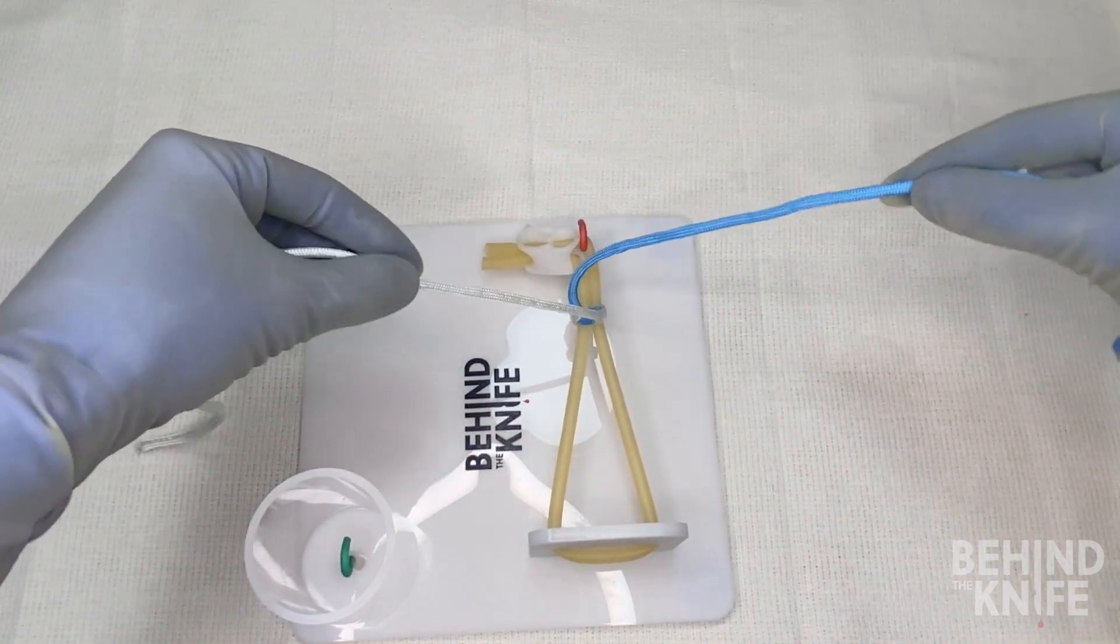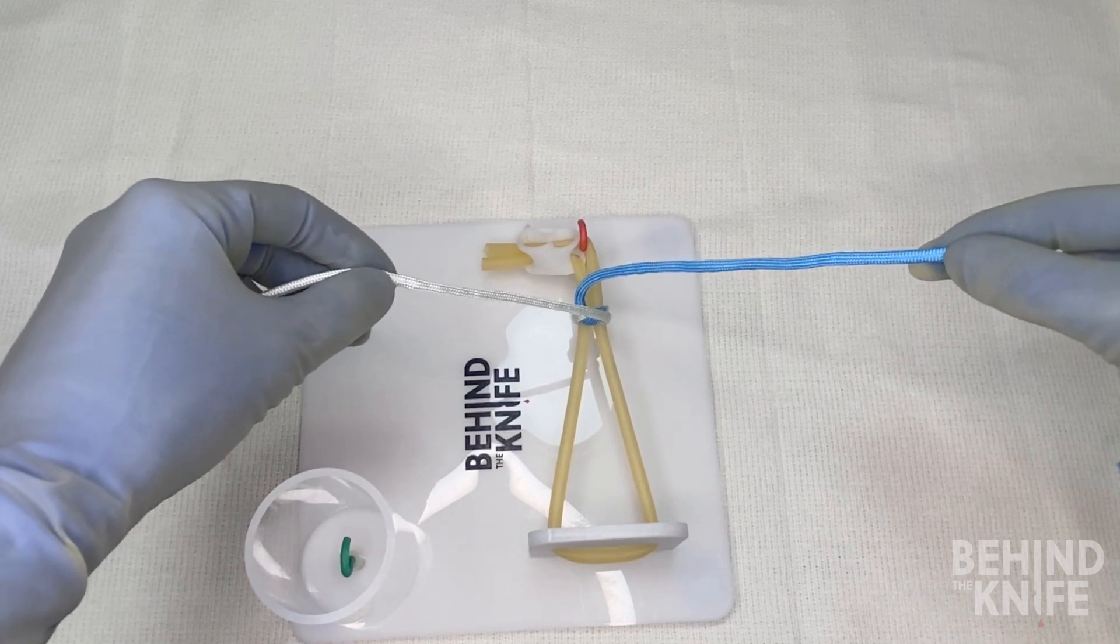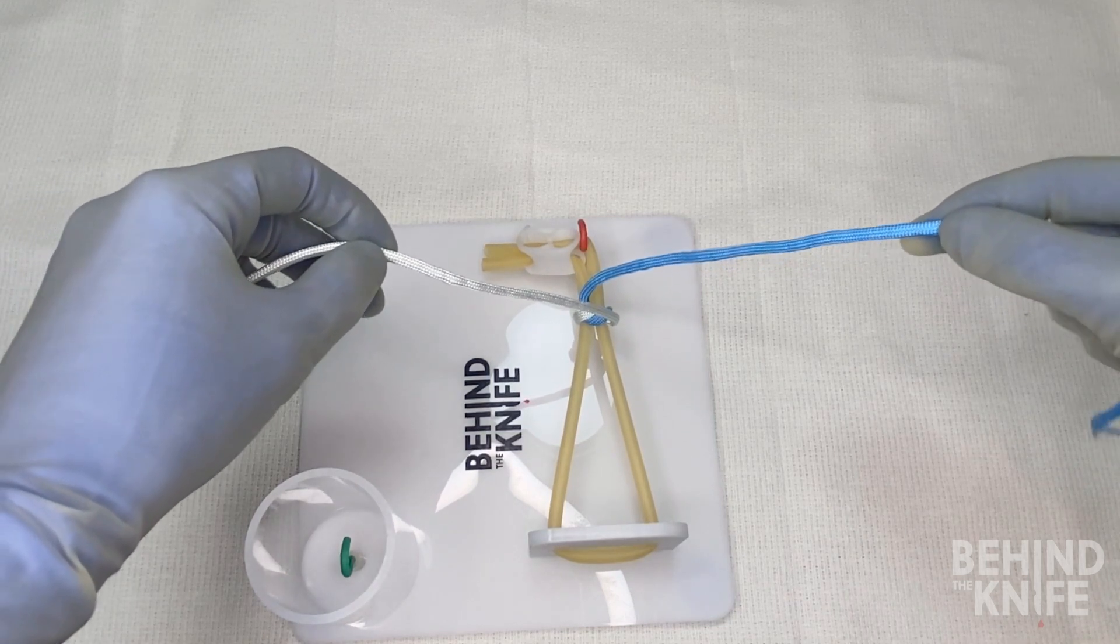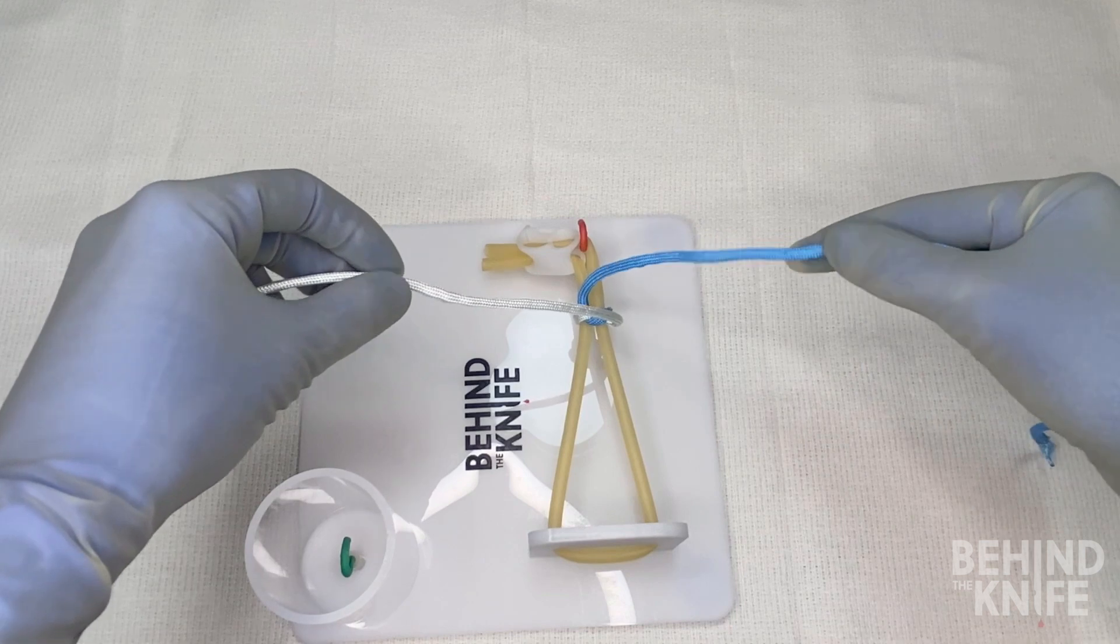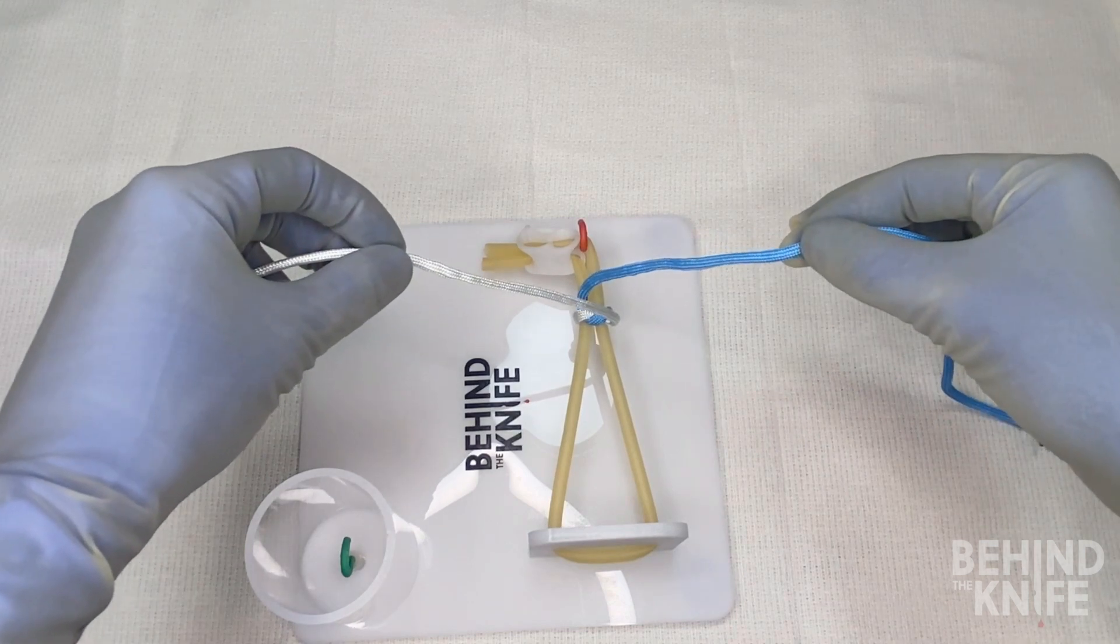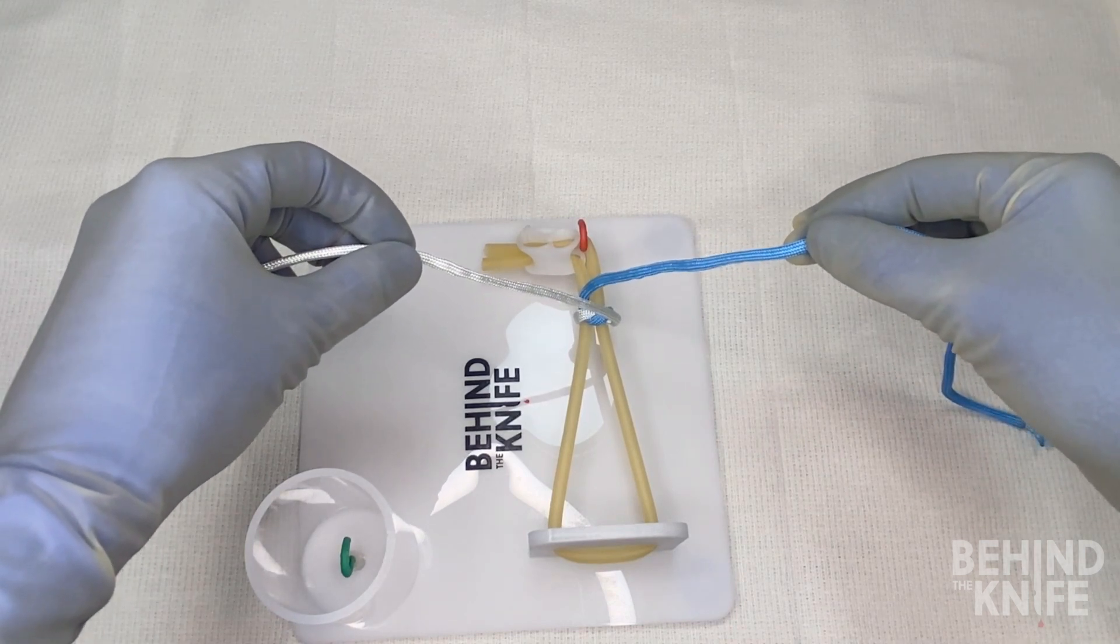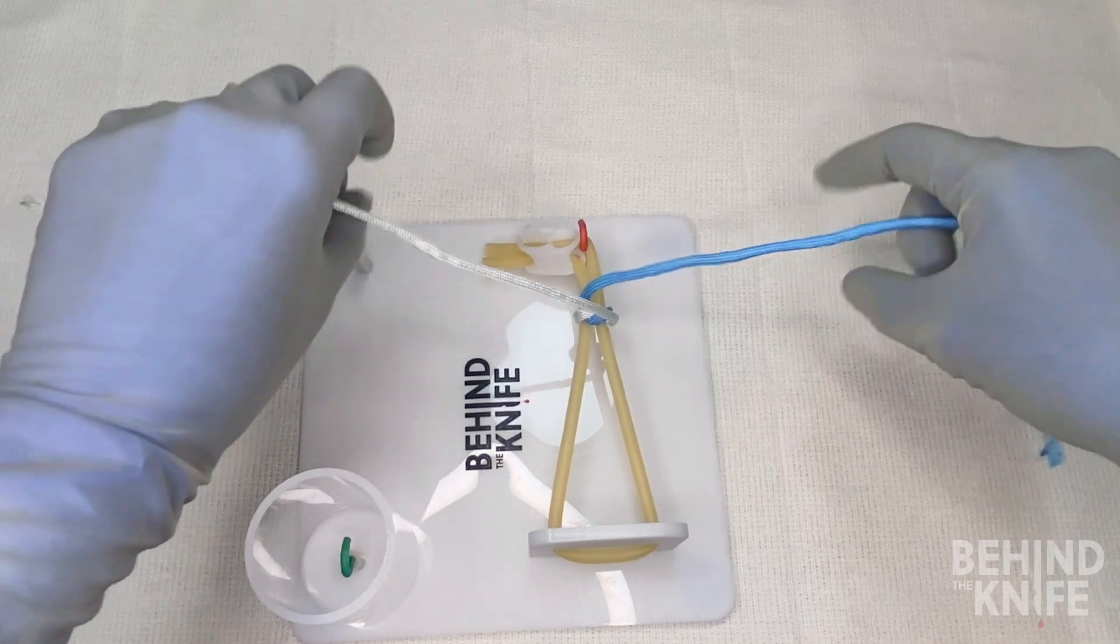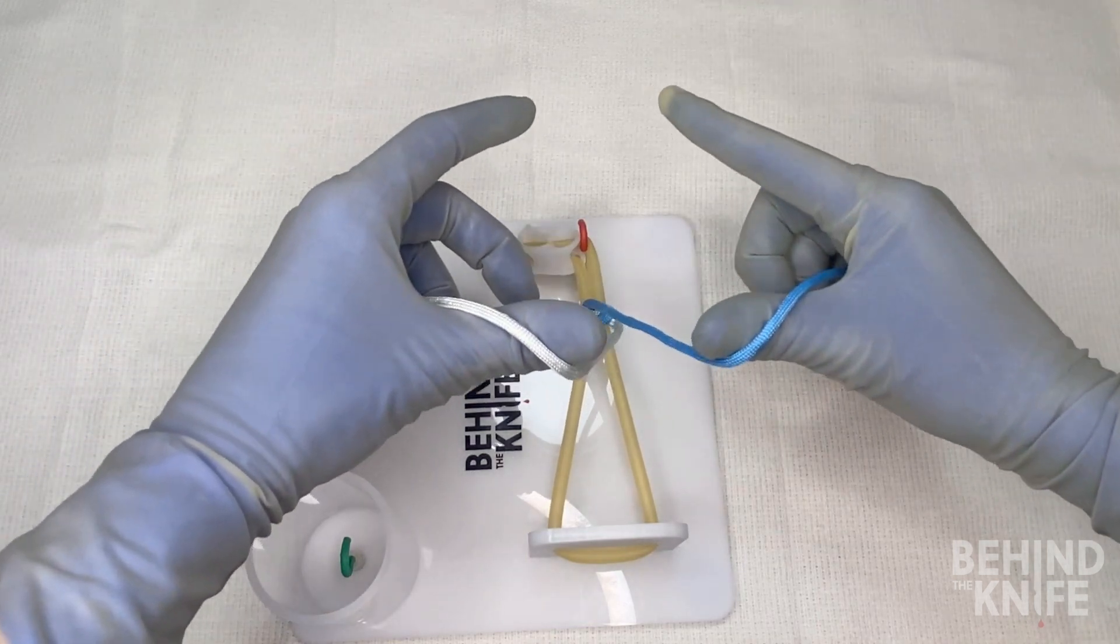Now this is just one half of our knot. In order to continue throwing square knots, what we'll have to do is switch from our L's to those C's that we talked about before. You'll pick up the same side of the string in the same hand that you had before, but instead of making L's, what we'll do is we'll make C's with the string draped around our thumb as such.